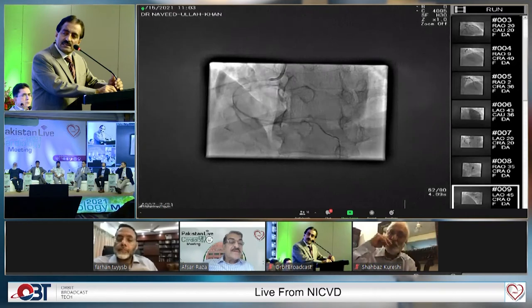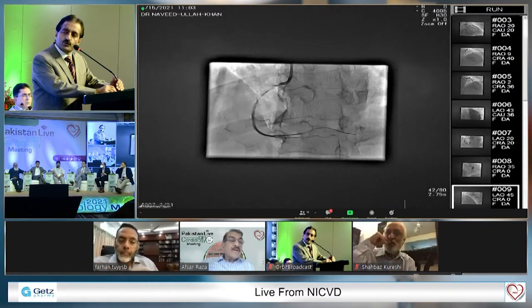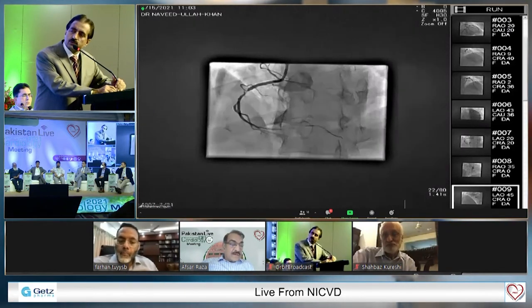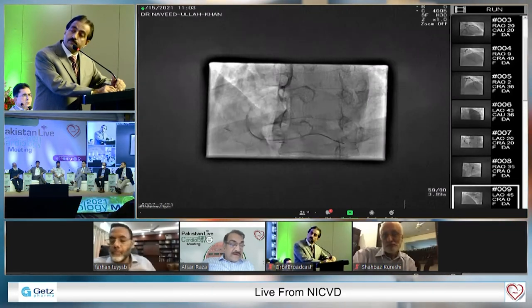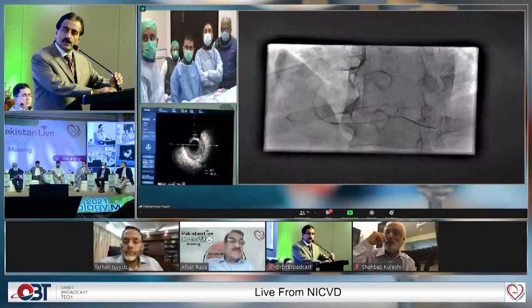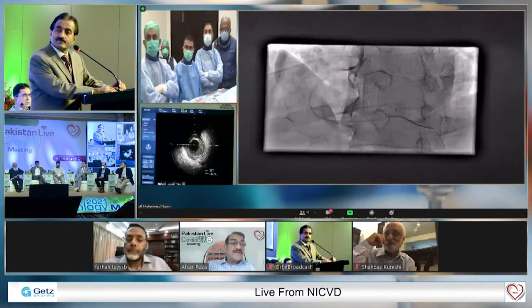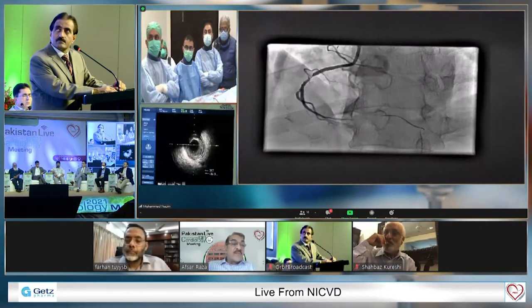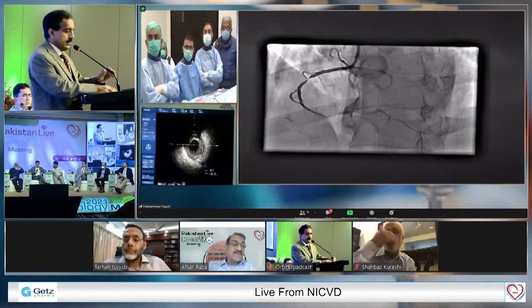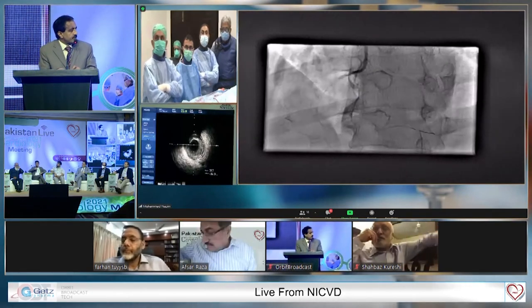So, Afzal, my question, that's what I was going to ask everyone, how often do you use aspiration? I know at NICVD they were using it quite frequently, and I'm going to ask Naeem also later on. No, but I think if we follow the latest guidelines, there is no recommendation because of the high incidence of stroke. It's class 3 according to the guidelines. Yes, that's correct. Unless it is really necessary with a large thrombus burden, and the flow is jeopardized, then that is the indication we follow. So would any of the panelists here be using aspiration?